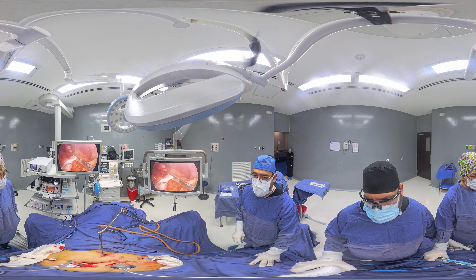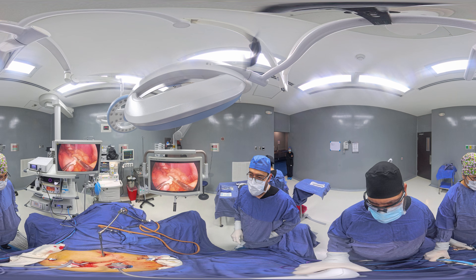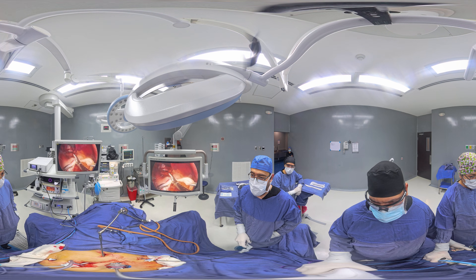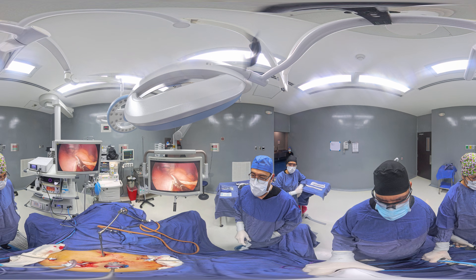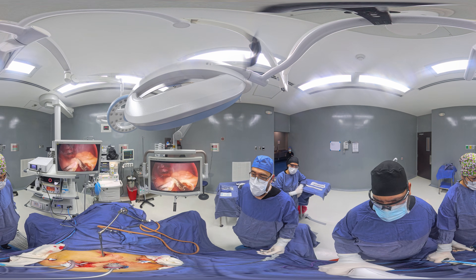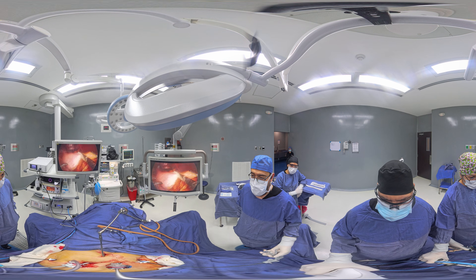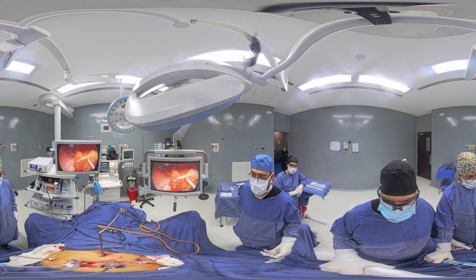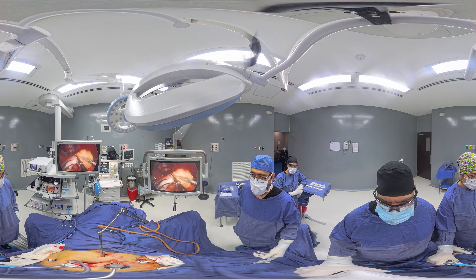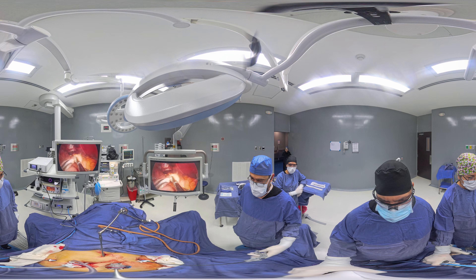Hello and welcome to this gastric sleeve surgical case. We will begin the surgery by dissecting the greater omentum on the greater curvature of the stomach. This right here is the stomach and we will work ourselves through to the upper part, the angle of His, which is the upper part of the stomach. We continue the same path working ourselves to the upper part of the stomach.